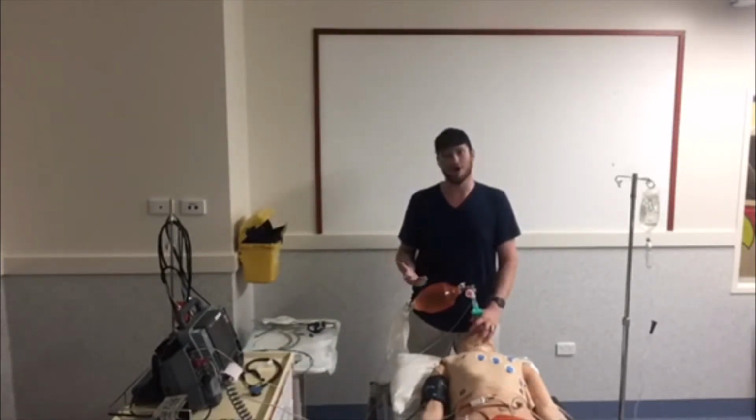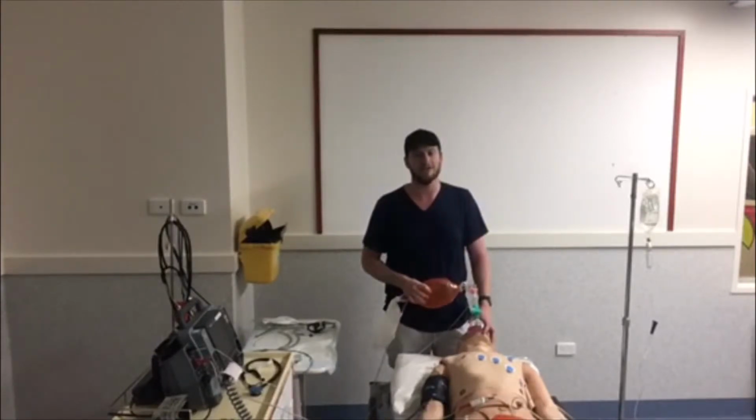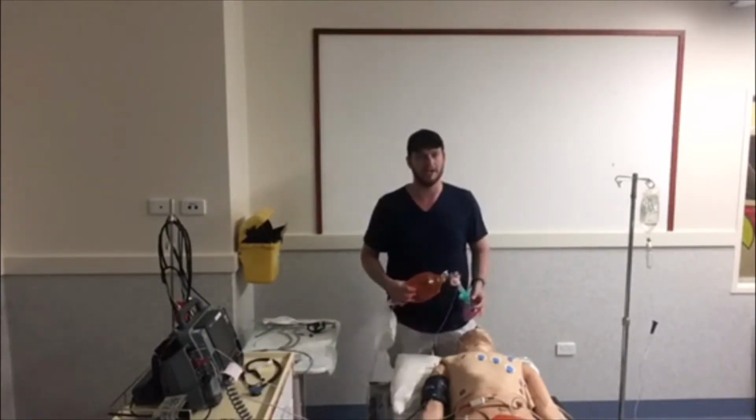For me, I go through a little bit of an acronym called SOAP-ME. So S for suction, O for oxygen, A for airways, P for positioning, which we've got at the moment, M for monitoring and meds, E for end-tidal, and any other equipment that we need.